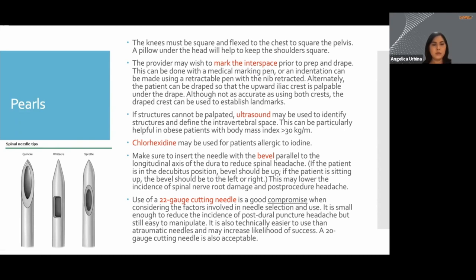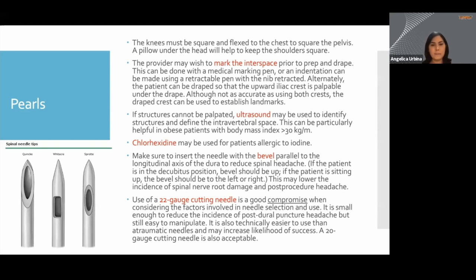The pro of using an atraumatic needle is a decrease in incidence of post-dural puncture headache. The con is that there's a lower sensation of feeling the pop when you go through the ligamentum flavum. Using a smaller bore needle also decreases the incidence of post-dural puncture headache. A 22 gauge versus a 20 gauge is a good compromise when deciding what needle to use.